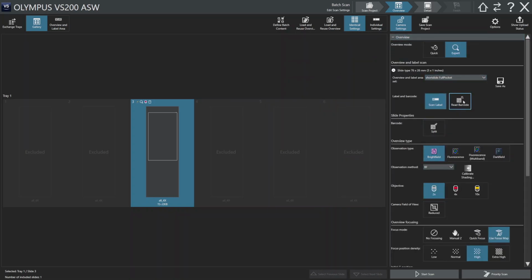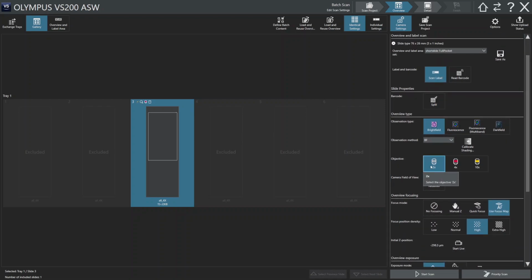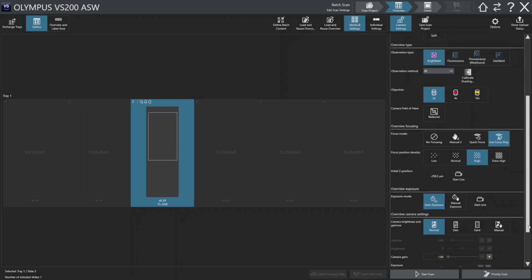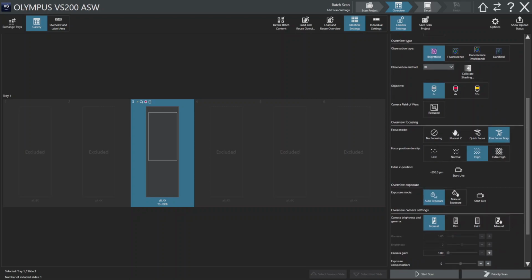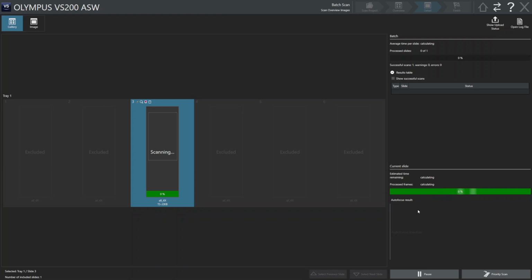You can now proceed with the full pocket scan and use the minimum magnification for making an overview. The bright field modality is a good option at this step. And the initial set position has been set up for you prior to this. So don't care about that or the exposure so much. In very special cases, it's important to check the exposure levels because some samples are different. They don't allow light to come through, so we will need to use reflected light instead of bright field.